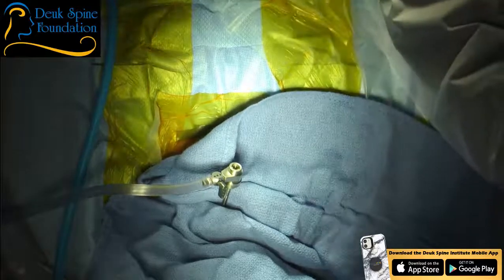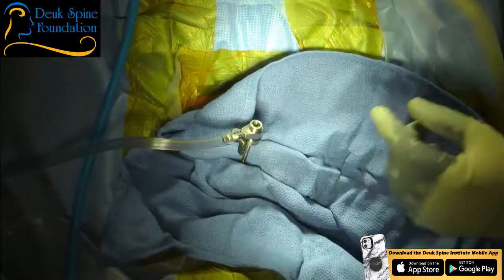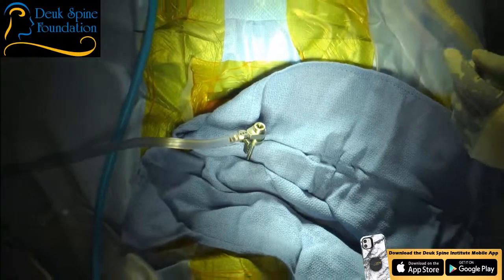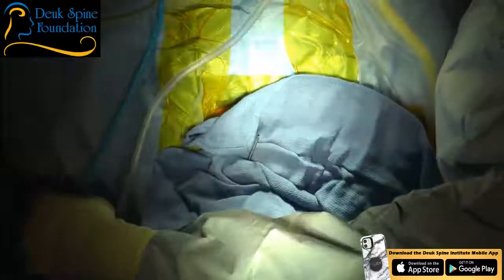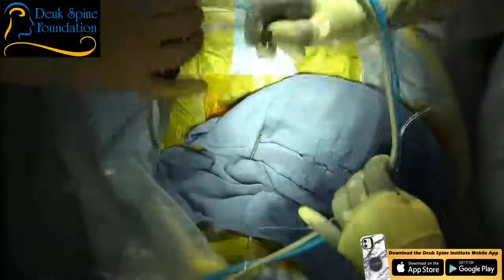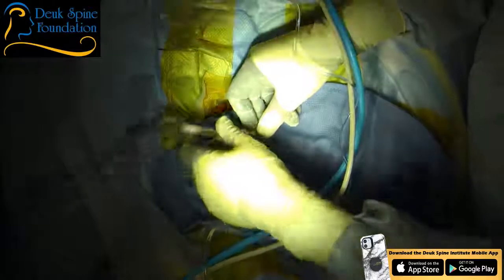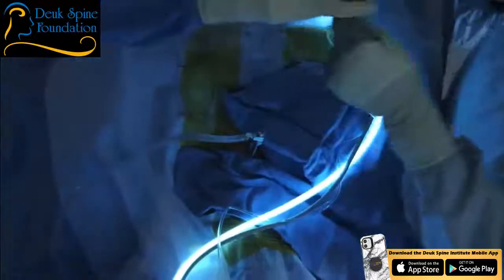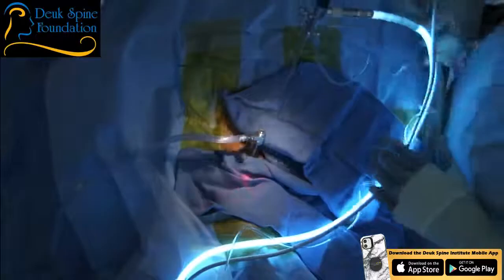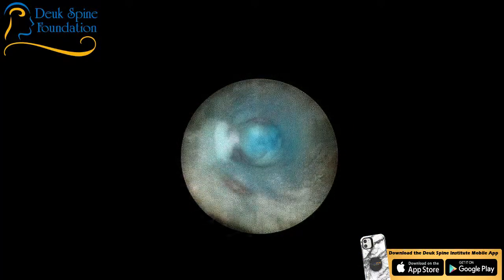We can see it. It's small, but these herniations are small fragments of disc material, nucleus that's in just the wrong place, basically, to cause pinched nerves. All right, at this point, we're going to go in and bring our scope in. So we're going to head down this tube, turn on our irrigation. You can see little fragments of blue, which is the nucleus pulposus, the herniation itself stained blue.